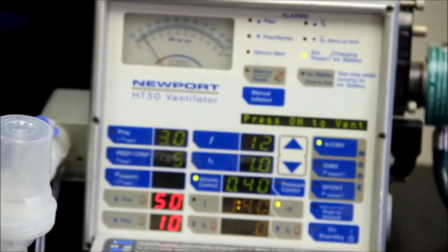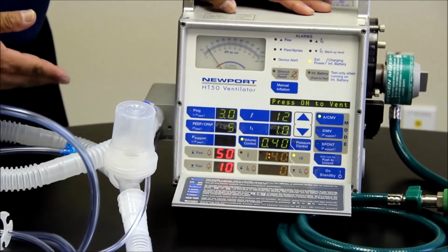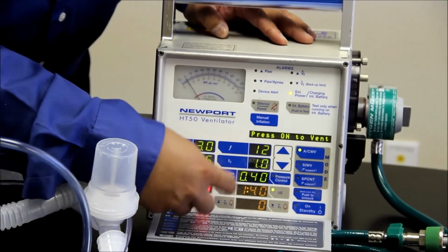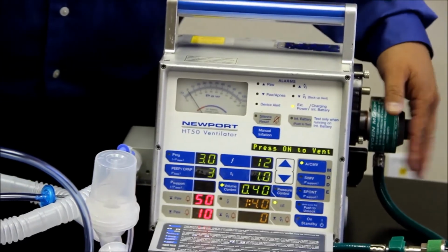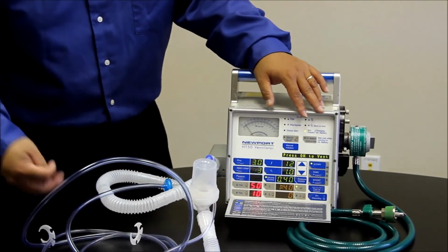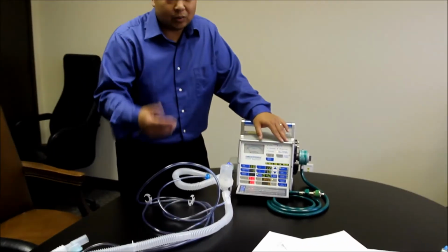So now that you have that, you have the patient on AC, respiratory rate of 12, tidal volume of 400, PEEP of 3, and an FiO2 of 30%. So this is what a typical volume ventilator rate would be. And the patient will be totally vented by us 100%.